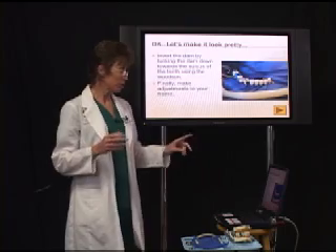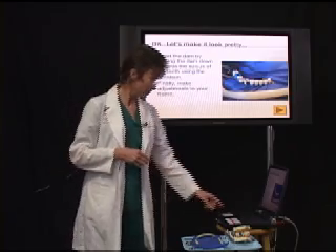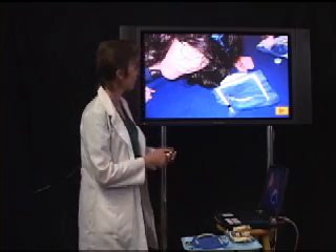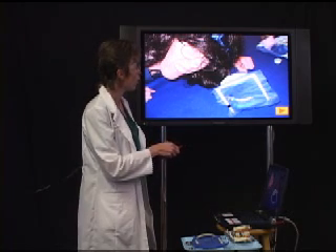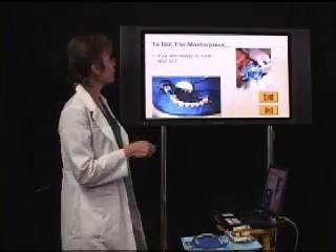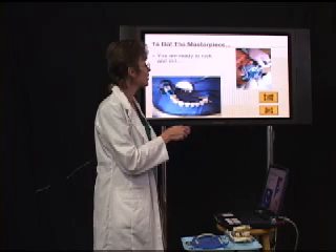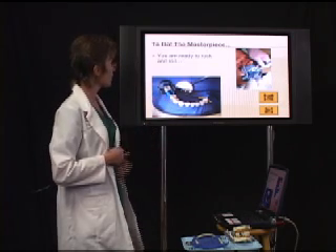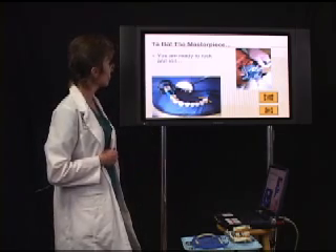Once you have it all inverted, your final adjustments will be made to the frame. The rubber dam frame goes with the curved part towards the chin, and the two open ends go up towards the eyes. This is the proper placement — the curved end goes around the chin and the two open ends of the horseshoe frame go up towards the eyes. Here you can see the final completed product: everything's inverted, very nicely isolated. And voila, you're done.